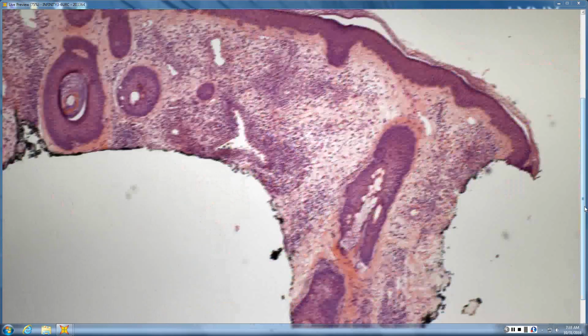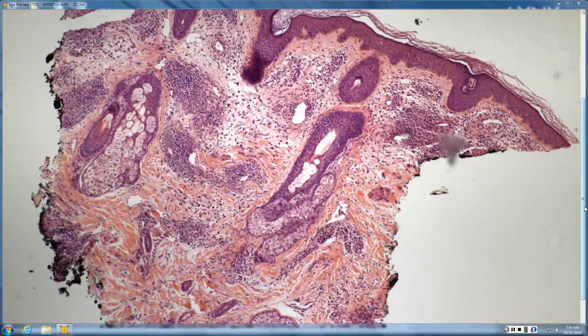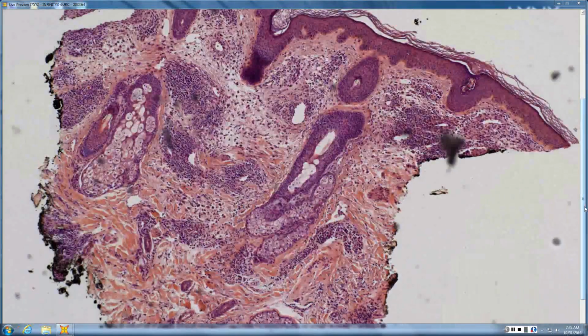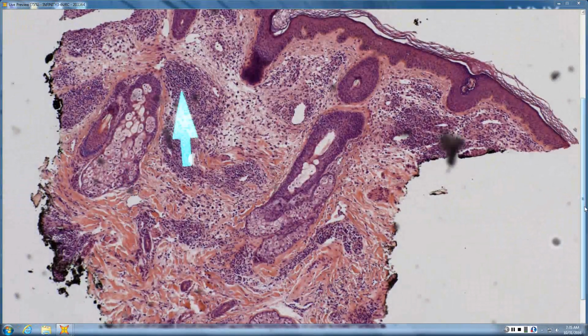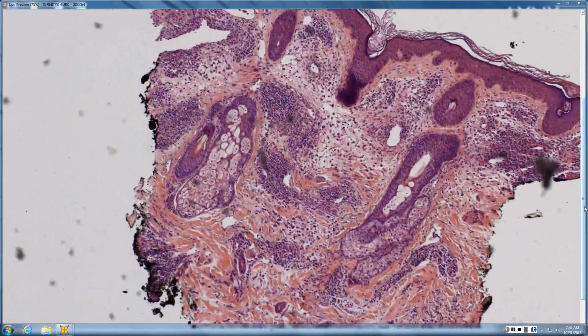Okay. Jessica, what do you see? So it looks like we're most likely on the face. Looks like facial skin. You have nodular lymphoid infiltrates around the vessels. Yep, imagine that in this chapter. Looks like there's some edema as well.